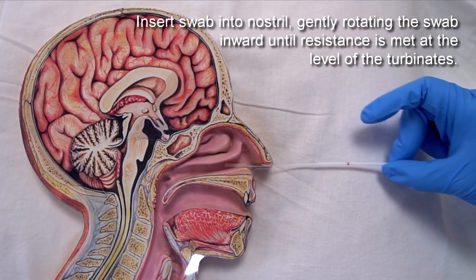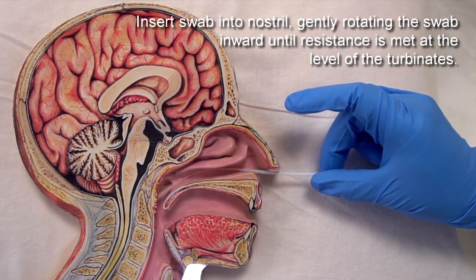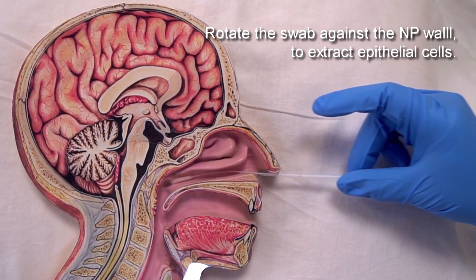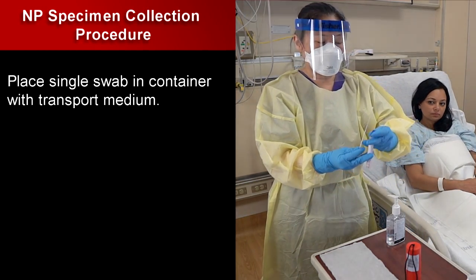Insert swab into nostril, gently rotating the swab inward until resistance is met at the level of the turbinates. This is the distance from the nostril to the external opening of the ear. Rotate the swab a few times against the NP wall to extract epithelial cells. Withdraw the swab and your hand from the patient's forehead. Place single swab in container with transport medium.